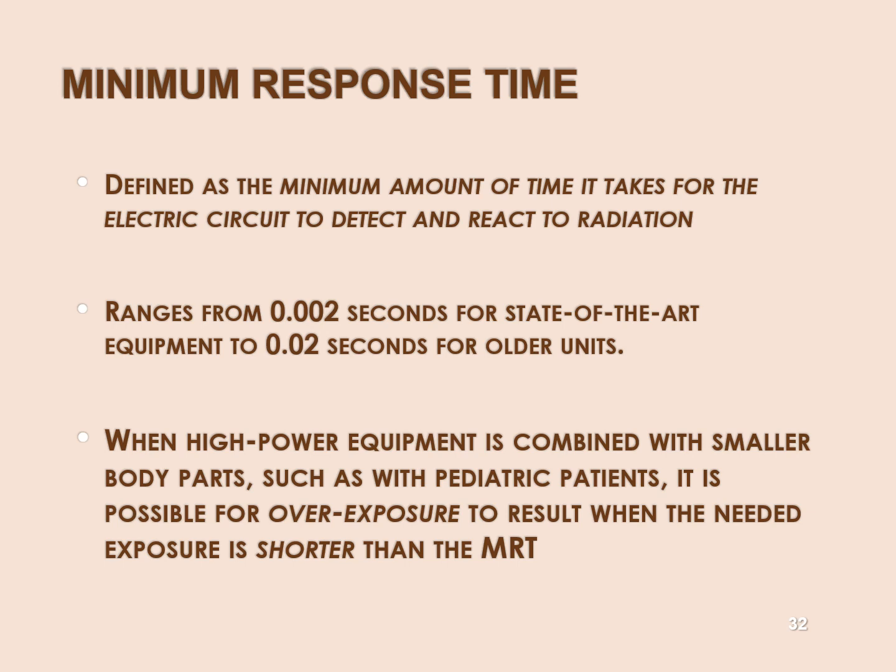So when high power equipment is combined with smaller body parts, such as pediatric patients, it's possible to overexpose because you have a minimum response time. So the expected response time for a pediatric extremity might be like 0.002 seconds. I think he might give an example on the next page, but the AEC can't terminate until 0.02 seconds.